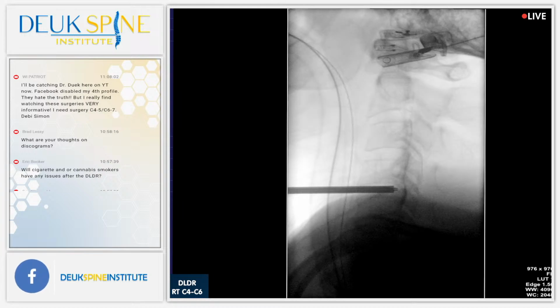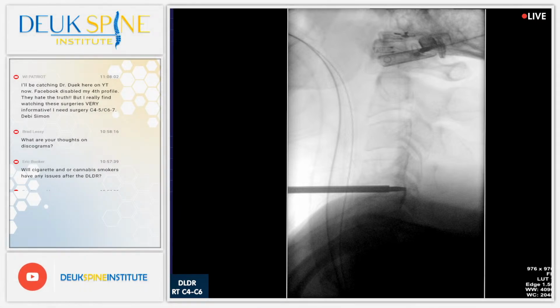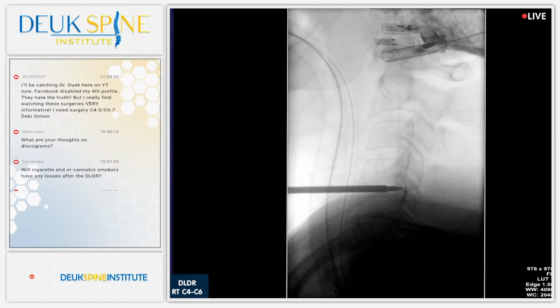Is that it? Right there? Oh. Yeah. Hold on. I want to go in a little more. It's pushed me back. I think all the scar tissue has literally pushed me back. Just gently. Okay. Let me see. Shot. See, it keeps moving.